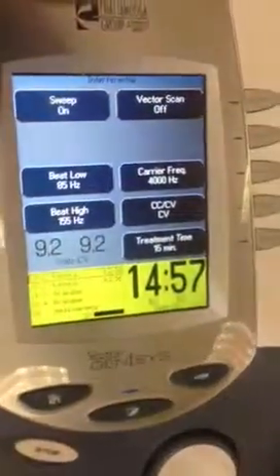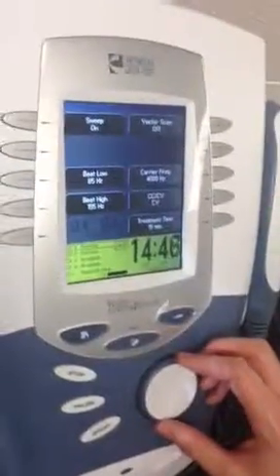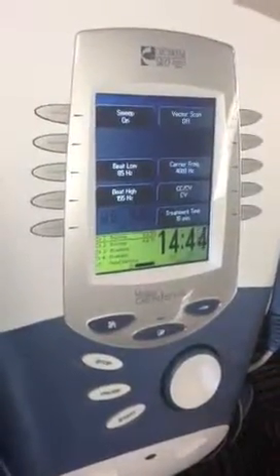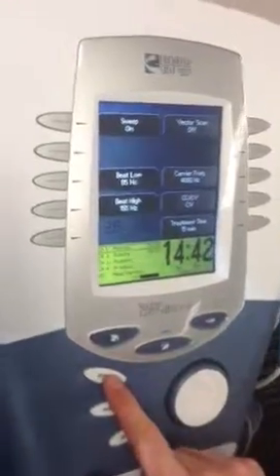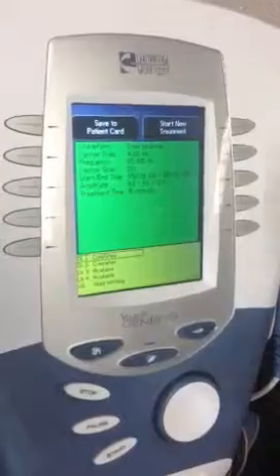So as that's starting, again, if the patient feels halfway through their treatment that they're not getting the sensation anymore, we can always adjust the treatment like so. You can adjust it to 9.6. So again, with this treatment, you'd want to make sure that you record the treatment parameters, make sure that you know what worked for them, if it did work for them, and you can always use that to review and adjust your treatment plan for this individual.